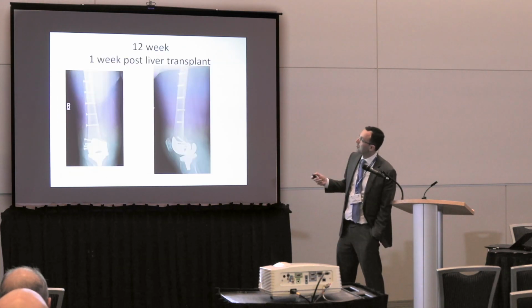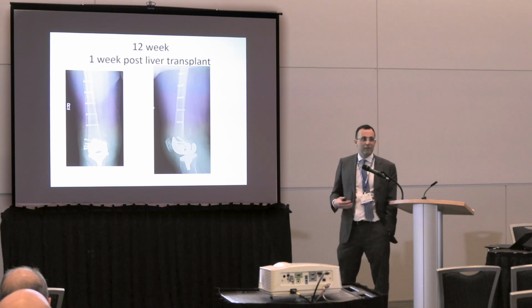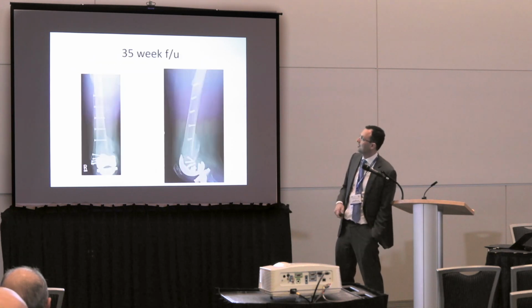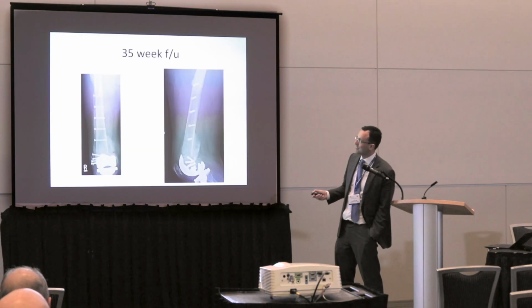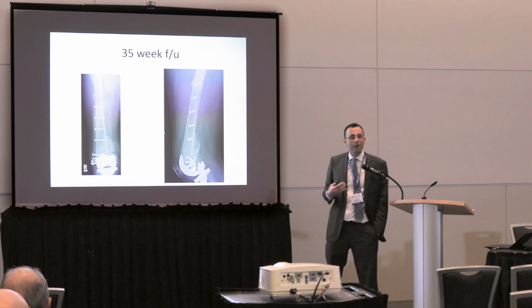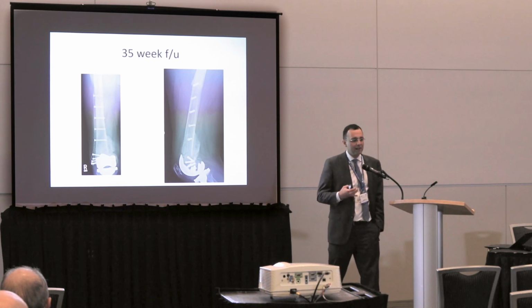She gets her liver at 11 weeks, follows up with me, and then I don't know if it was the implant or in fact she got a new liver, but I mean, look at this. I mean, just healing like a champ. And then just continue to heal to a point that her main thing, she's got this bump here.